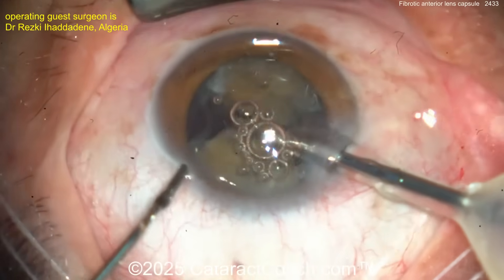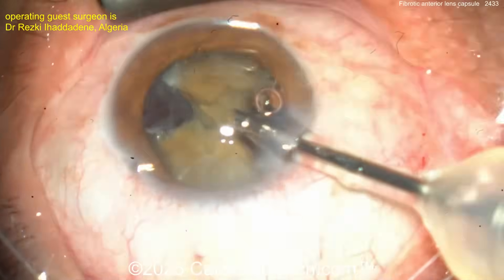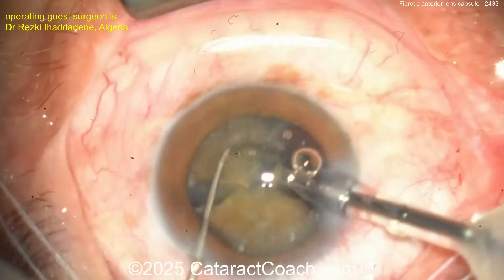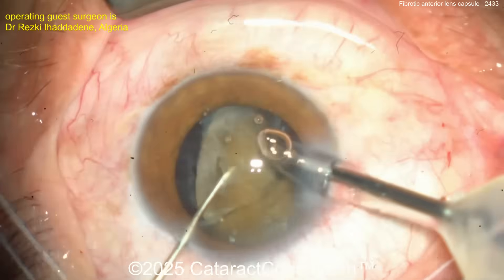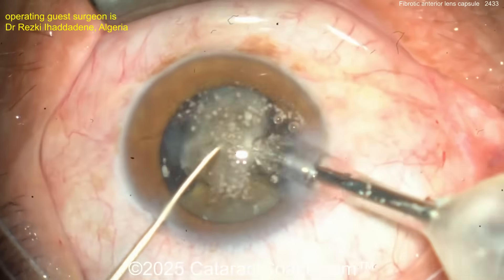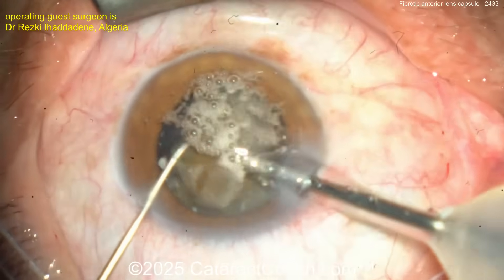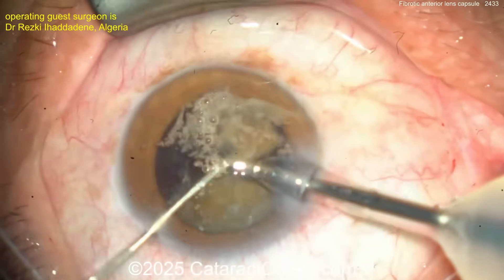Switching instruments — more viscoelastic. Smart move: recoat the endothelium with a dispersive viscoelastic agent. Back to the sharp chopper. Viscoelastic is cheaper than endothelium, for sure. Now aspirating and phacoing down these little quadrants. The air bubbles are like champagne — free, don't worry about it. Getting rid of those pieces.